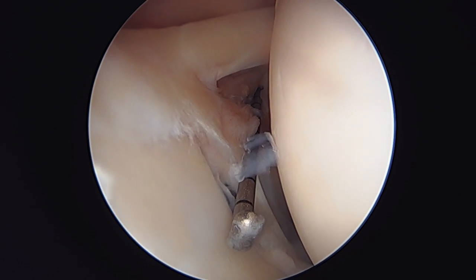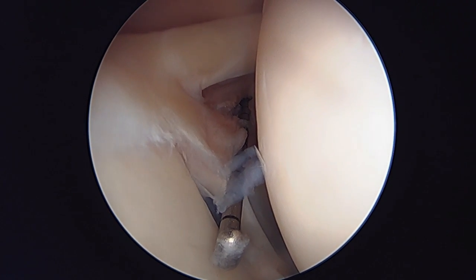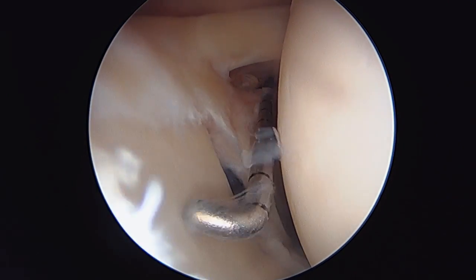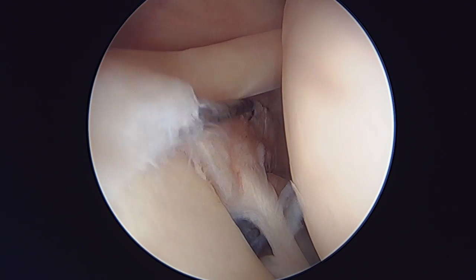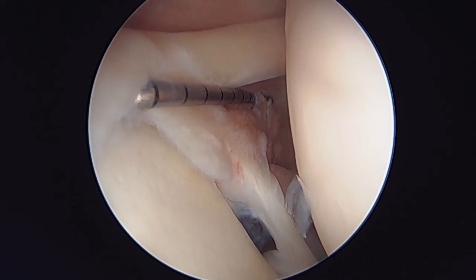Here we are inside the glenohumeral joint. To my right is the humeral head, and to my left is the glenoid surface. This is the infamous SLAP tear — specifically a type 2 SLAP tear in about a 40-year-old patient.